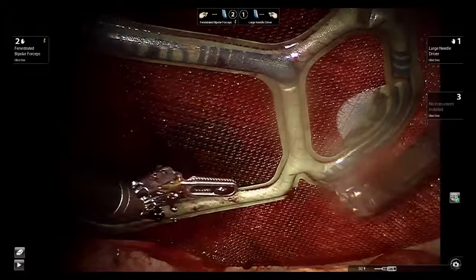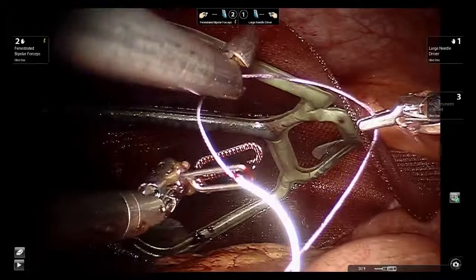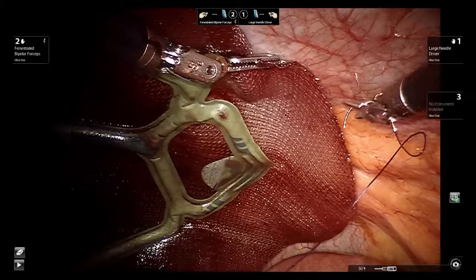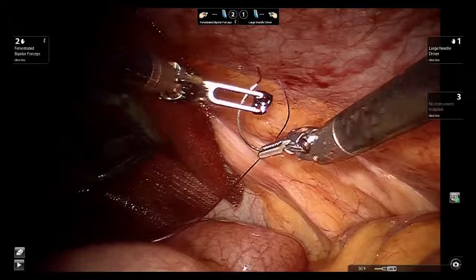We now proceed to suture. We will start suturing at the halfway point and proceed circumferentially halfway. Then another suture will be started and run circumferentially on the other half of the mesh.